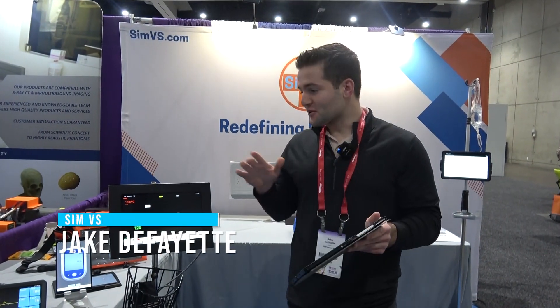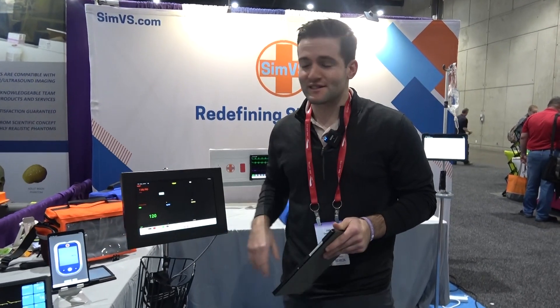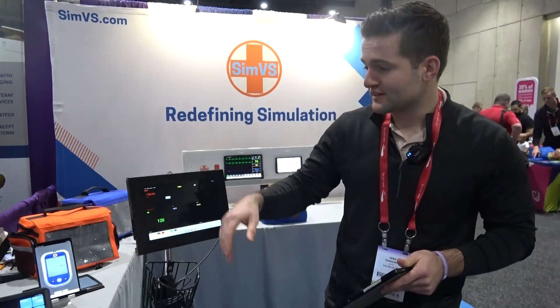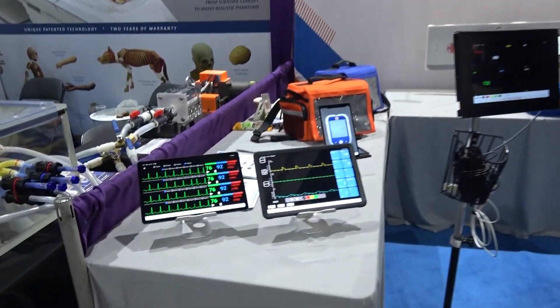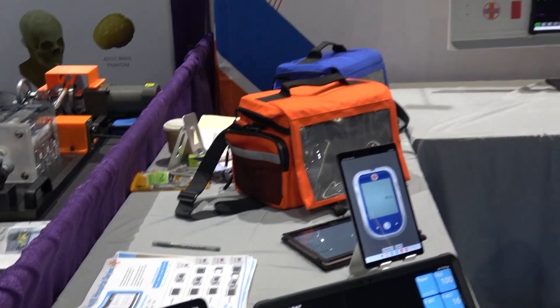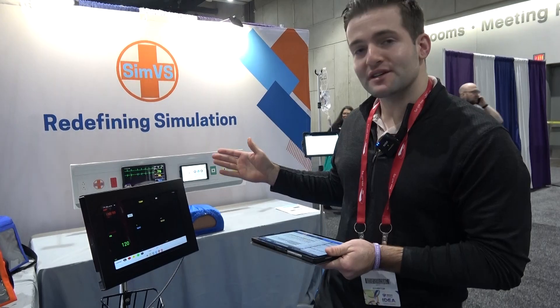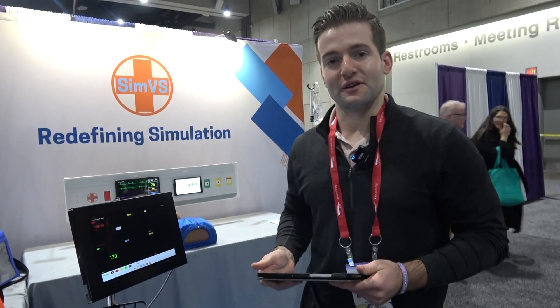We hope you'll join us February 6th for a deep dive on this scenario. Hi everyone, I'm Jake from SimVS. I'm going to do a quick overview of the SimVS simulated monitor ecosystem — everything from low-fidelity point-of-care devices to higher-fidelity ventilators, telemetry monitors, and everything in between. Our systems start at approximately $3,000 and increase from there, so whatever your simulation use case may be, we do have a monitor for you.